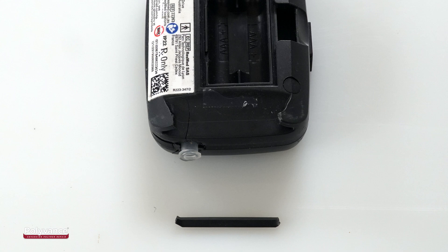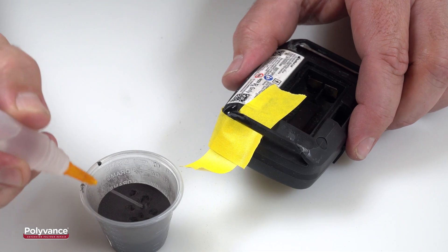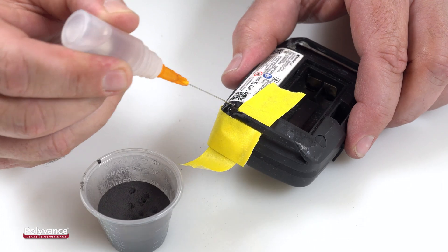In this video, we will show you how to repair the ABS case of a Sleep Apnea Monitor using Polyvance's 2503 Black PlastiFix Repair Kit.